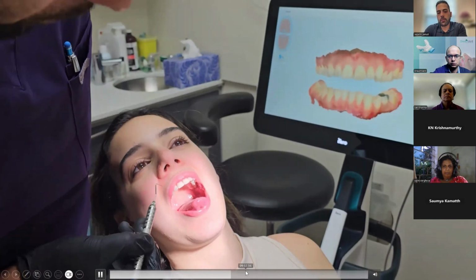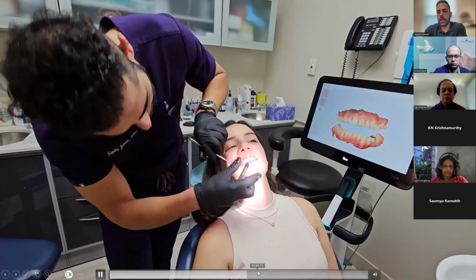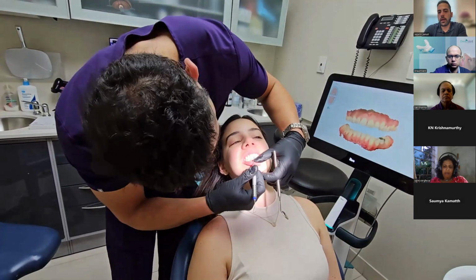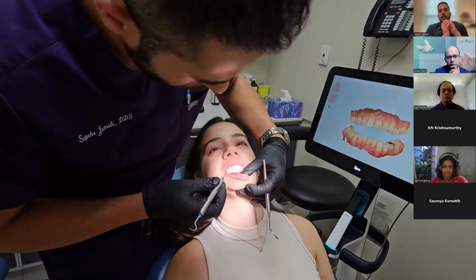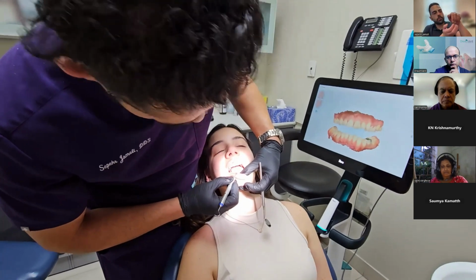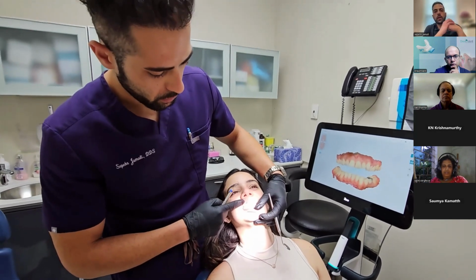After the extraoral examination, as we mentioned, we're going to check the Mallampati, the tongue, and the occlusion. The amount of overjet is also very important. For example, this patient we're examining had around 5 millimeters of overjet. And if we start making the appliance from the edge-to-edge position, which most patients are going to be comfortable in, we can start the titration phase.